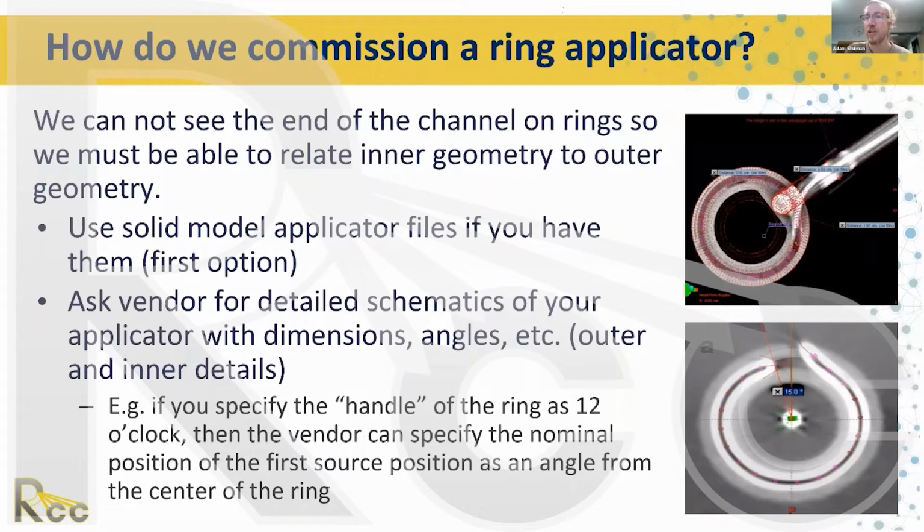And the application of those differences we'll get to later on. So I won't go over that explanation now, but that's the biggest thing. You need to know where they are in the TPS and then relate those same distances to where they are physically. And that's how you'll commission those differences.